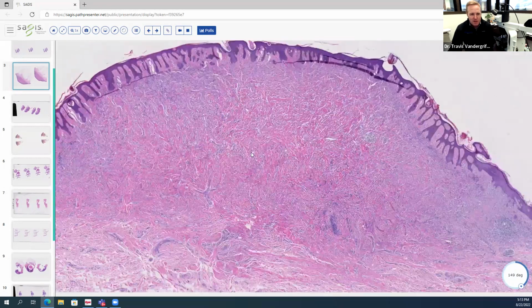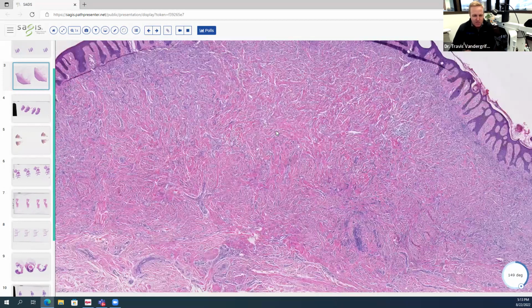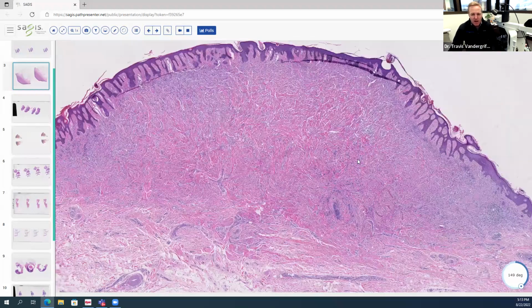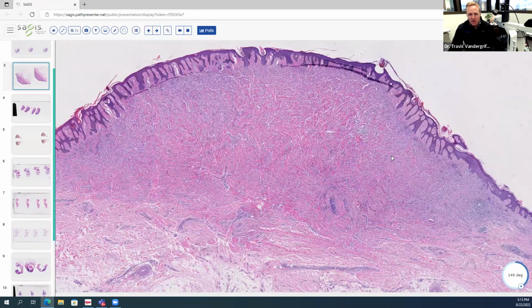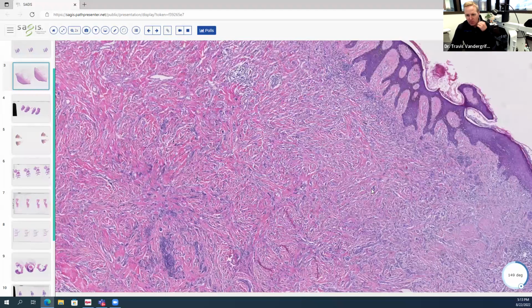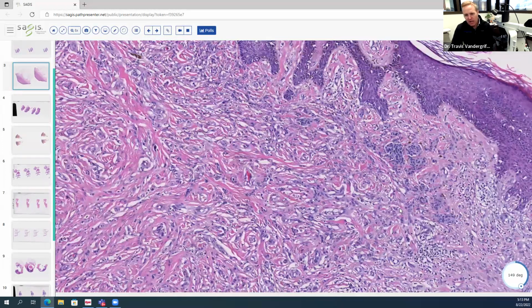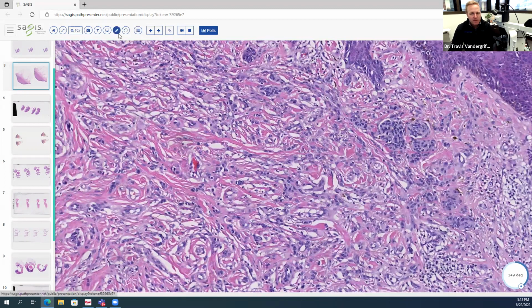This may be a little bit bigger than most of our small neoplasms, but overall a benign appearing lesion. And as I go to higher magnification, I can see, okay, we have in the superficial part of the dermis what look like nests of melanocytes. So I see nests of epithelioid cells with the gray cytoplasm here in the superficial part of the dermis.